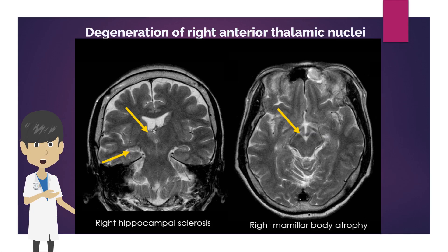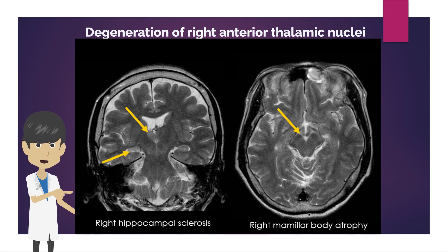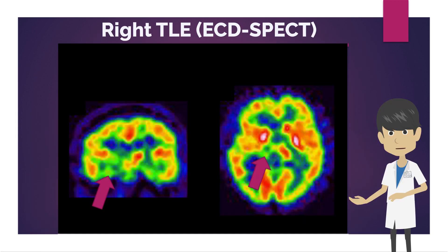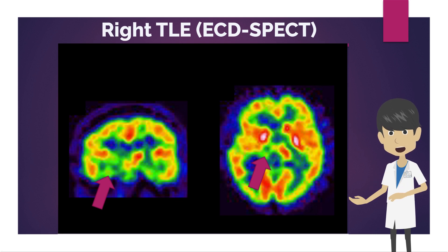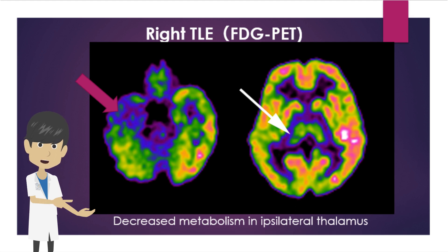Neurodegeneration in temporal lobe epilepsy via the Papez circuit can be seen on MRI. T2-weighted images show right hippocampal sclerosis and high intensity in the right anterior thalamic nucleus. There is also atrophy of the right mammillary body. In right temporal lobe epilepsy, decreased perfusion in the right thalamus is seen on brain perfusion SPECT, and FDG PET shows decreased glucose metabolism in the right thalamus, due to deafferentation through the Papez circuit.